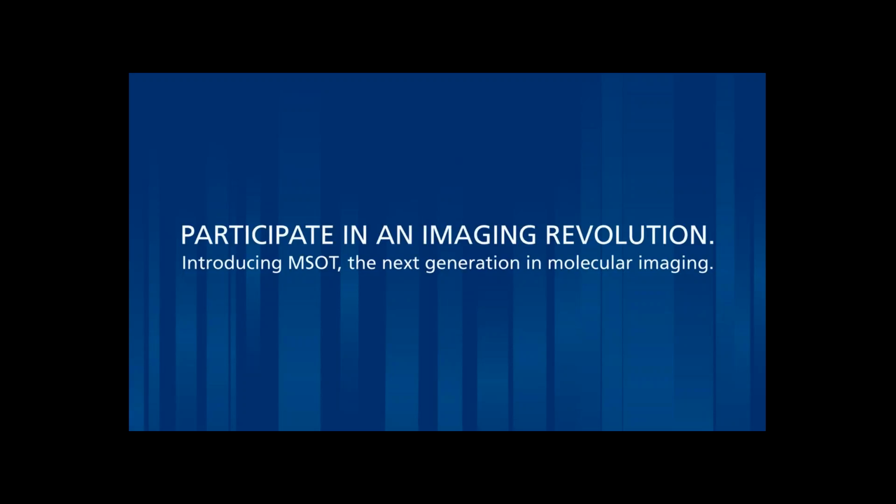So it is necessary to use a mouse that doesn't have hair. You can either shave the animal or use depilating cream, or you can use nude mice, depending on your application. In the context of C57 black mice, it is certainly possible to shave and image these mice. We've done this many times.